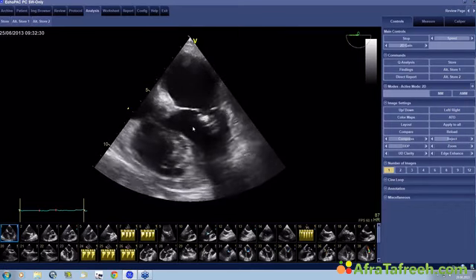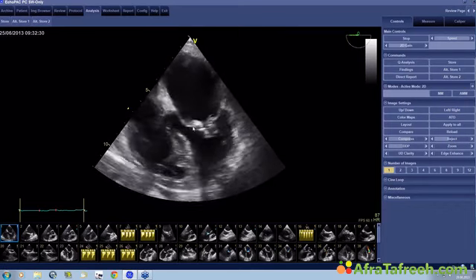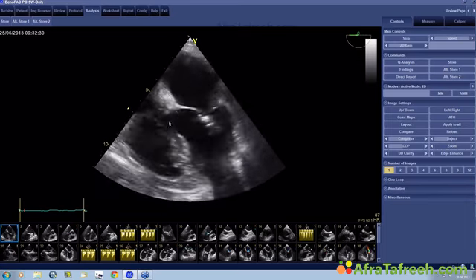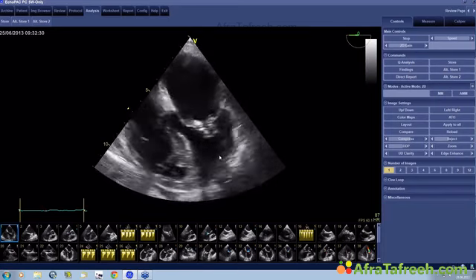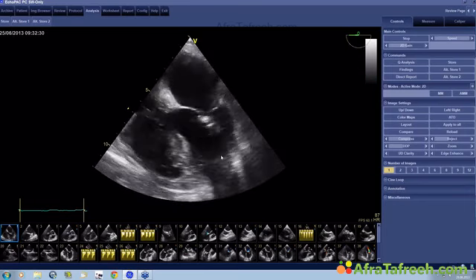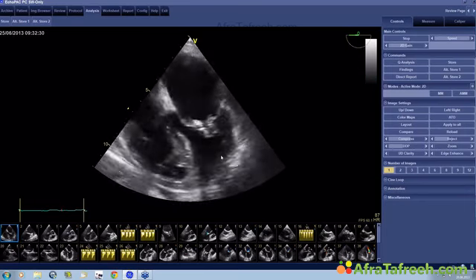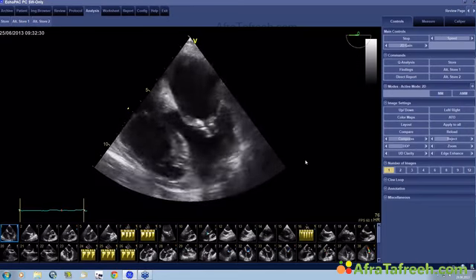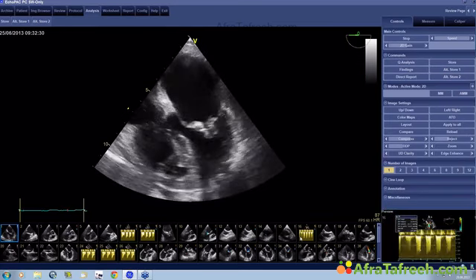In this case, we also use TE, simply for the reason that I explained before, because we thought the valve is maybe not the ideal valve to look at. And when these patients are on the table and they don't have such good image quality to start out with, it's probably a good idea to have a probe inside and to do the whole thing under anesthesia and to have the patient monitored by TE.